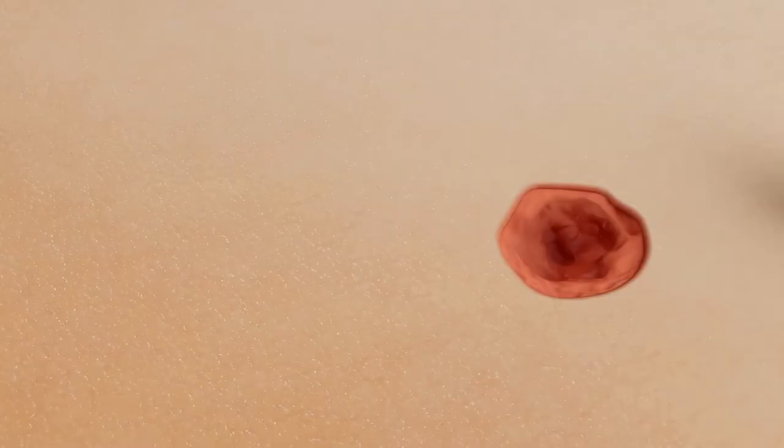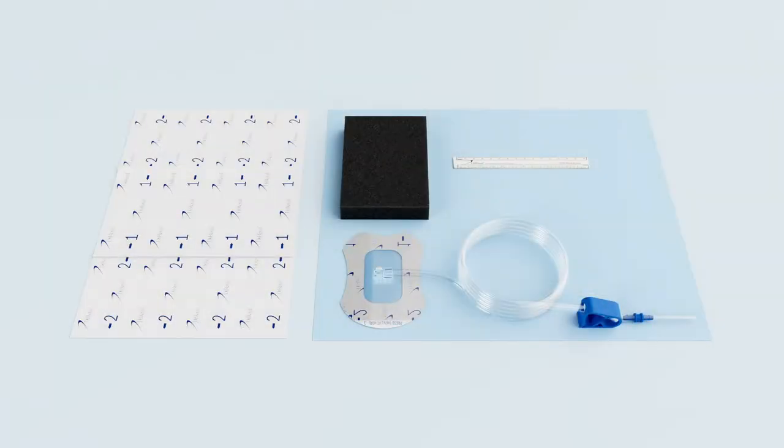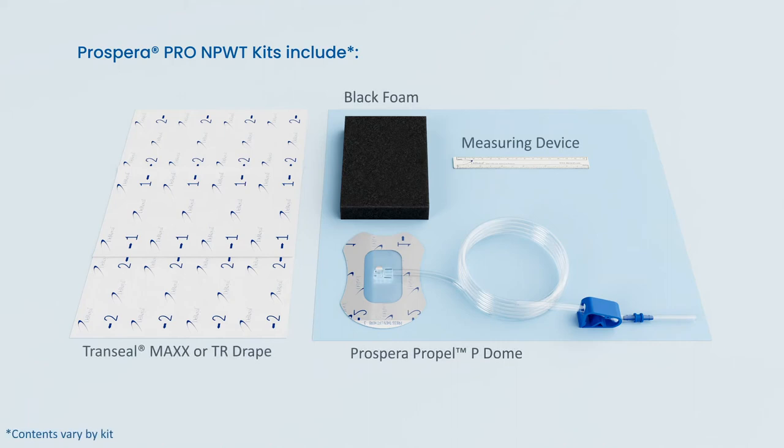In preparation for the application of NPWT, cleanse the wound and peri-wound areas. Open the dressing kit and remove the contents.